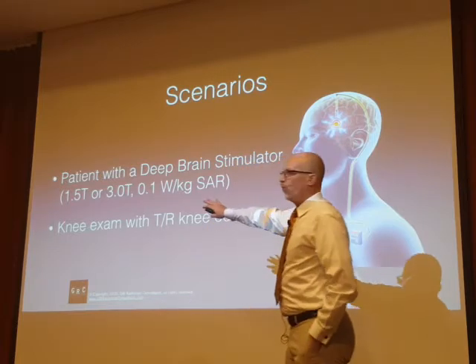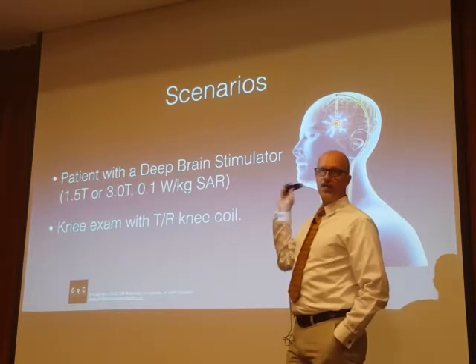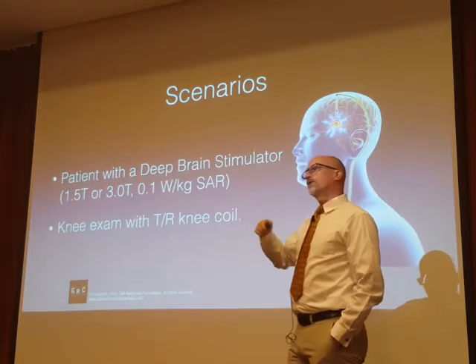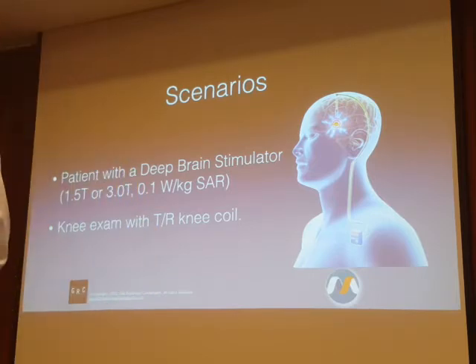When you see just one limited set of conditions, it usually means that the manufacturer presumes that you're imaging the implant. Which is a good reason, when you're not imaging the implant and the MR conditionals only describe one set of conditions, to treat it with suspicion, to think that they're describing imaging the implant alone.